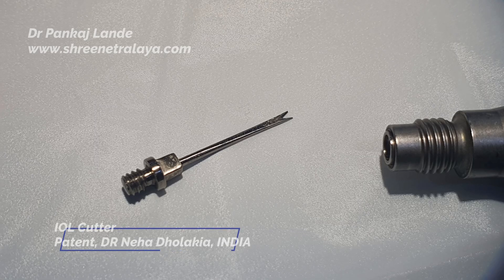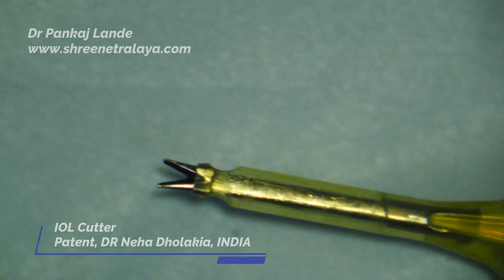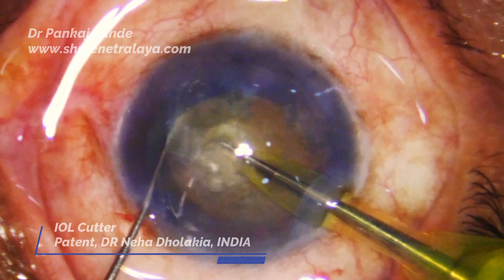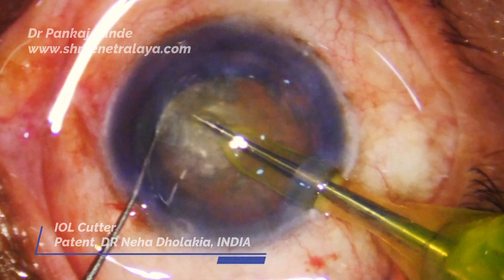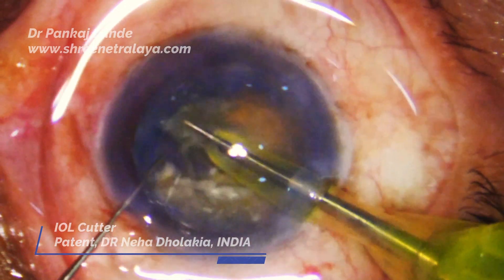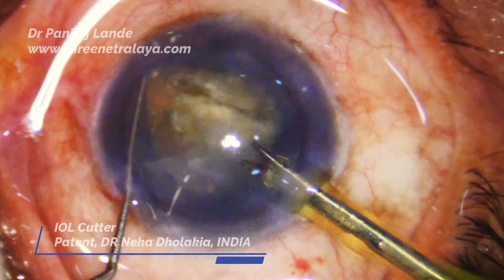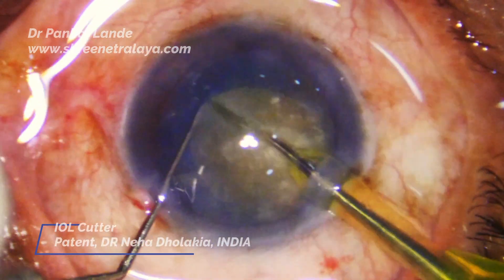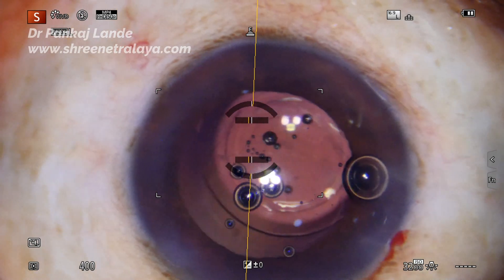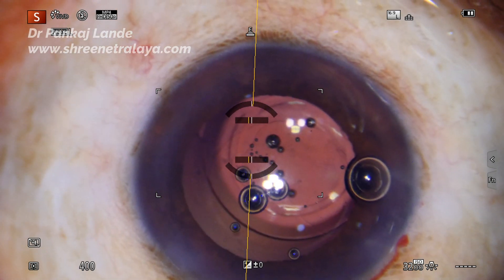This is an innovation from Dr. Neha Dholakia — she developed it as an IOL cutter, but I have also utilized this instrument for nucleus cutting as an ultrasonic pre-chopper. Videos for the same are available on my YouTube channel. It works wonders — it has performed great in hard cataracts and I could pre-chop them very well with this instrument. Now let's see the IOL cutting part.